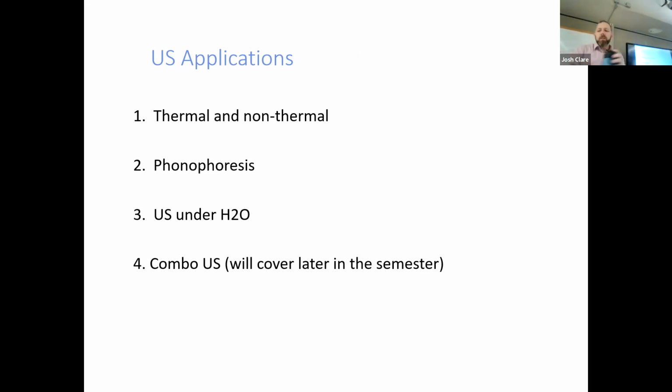Some of the applications, we're going to talk a lot today about thermal versus non-thermal. That's what I want to focus on for today. Next week, we're also going to talk about phonophoresis and how we could use ultrasound underwater. Later in the semester, we're also going to look at combo ultrasound, which takes the electrical stimulation and delivers it through the sound head. That's kind of cool.